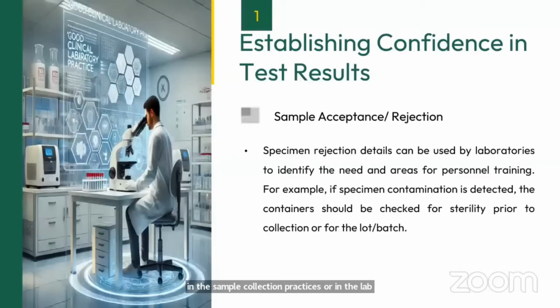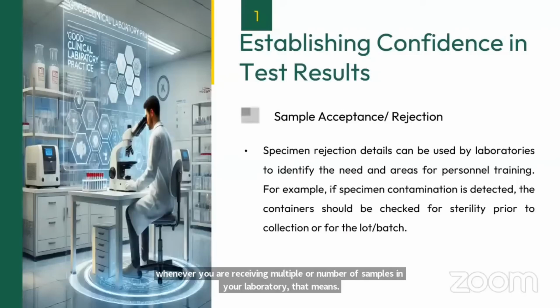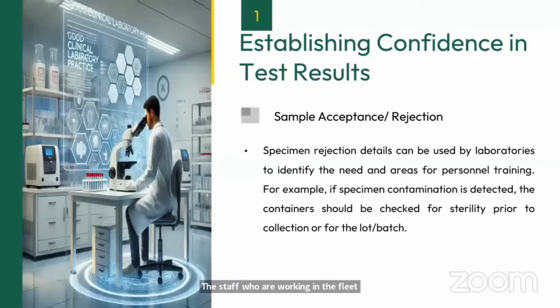Many times we receive multiple hemolyzed samples. So that means a faulty collection technique has been used. So whenever you are receiving a number of hemolyzed samples in your laboratory, that means the staff working in the phlebotomy areas are not properly trained. So it will give you an input that additional training is required in these areas.